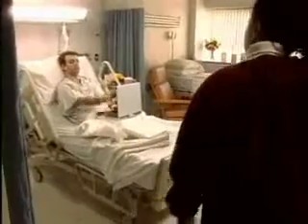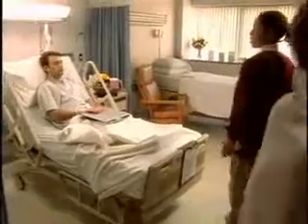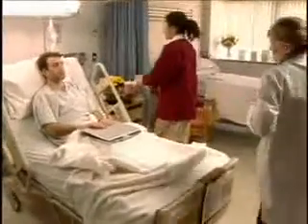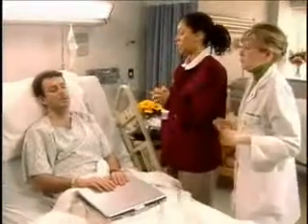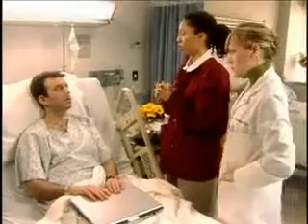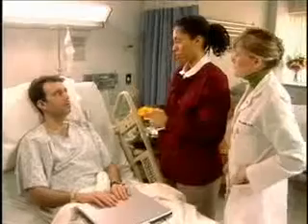Hi, Mr. Simon. This is my nursing instructor, Miss Lewis. Hi. Your doctor wants us to change the way we're giving you oxygen, so I'm going to put a face mask on you, and this is going to give you more oxygen and help you breathe easier.